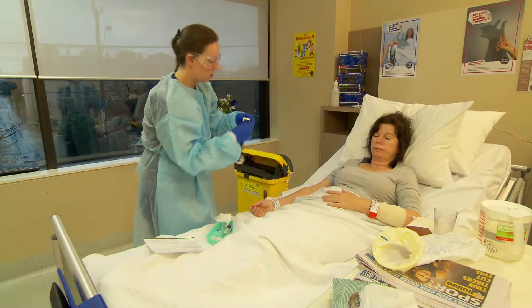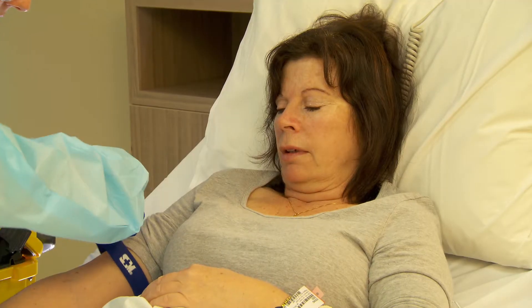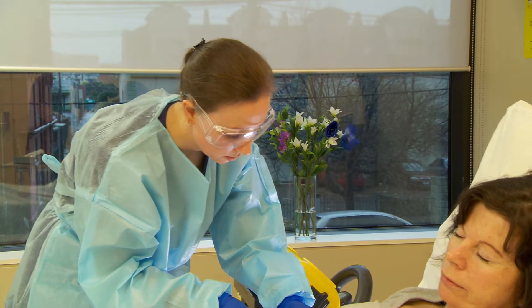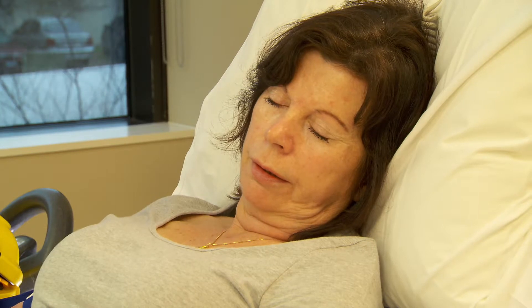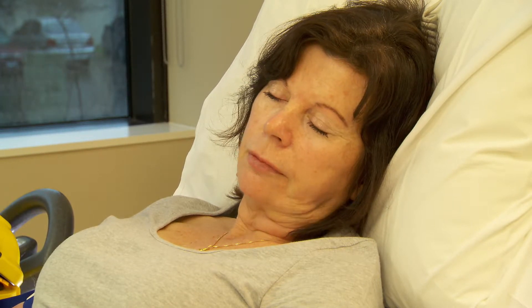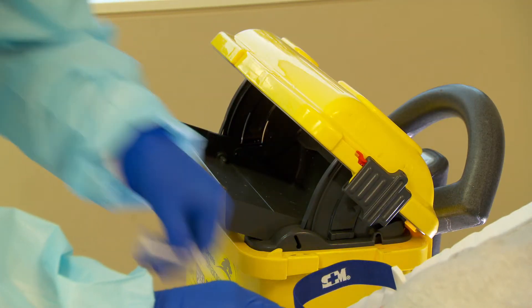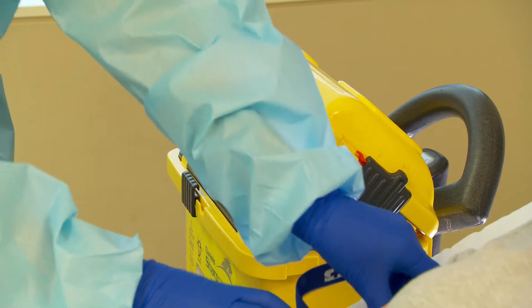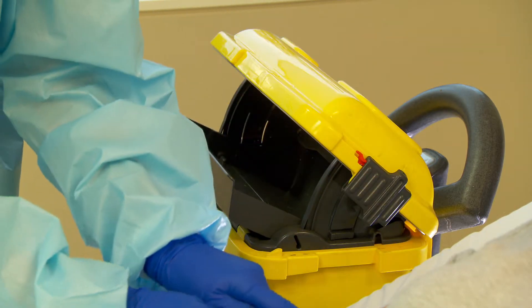Alicia can now have contact with the patient and the patient's environment. She applies a tourniquet and performs the blood draw, advising the patient of a sharp scratch. After the procedure is complete, sharps equipment is immediately disposed of in a sharps container at the point of care. Alicia then informs the patient she will send off the samples and return with something for the nausea before exiting the patient's room.